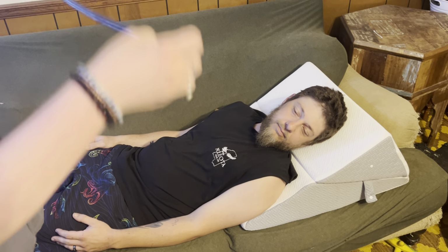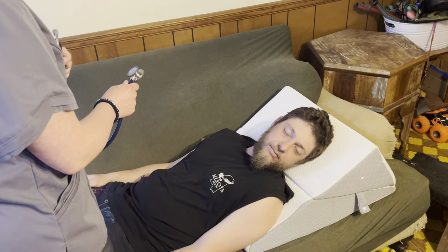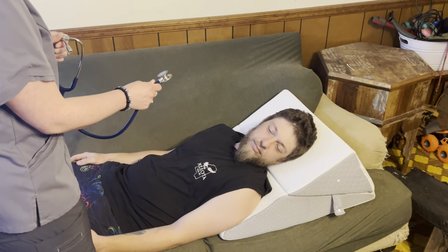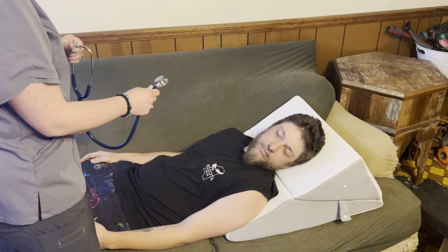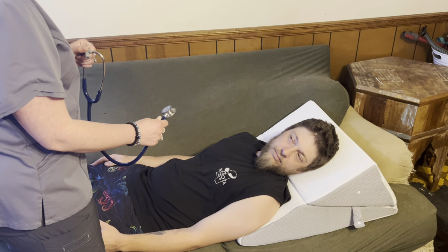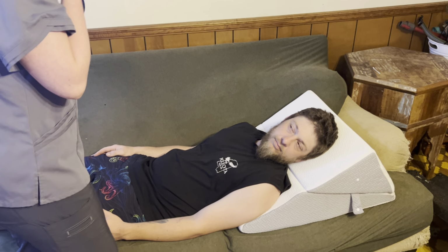All right, so now I'm going to be listening to the heart. I'm going to start at the right sternal border at the second intercostal space, the aortic region. I'm going to move to the left sternal border at the second intercostal space to listen to the pulmonic. Move down to the third intercostal space on the left sternal border to listen to Erb's point. Down to the fourth intercostal space on the left side for the tricuspid. And then I'm going to move to the left midclavicular line, fifth intercostal space, and listen to the apical region. I'm going to be doing that now.